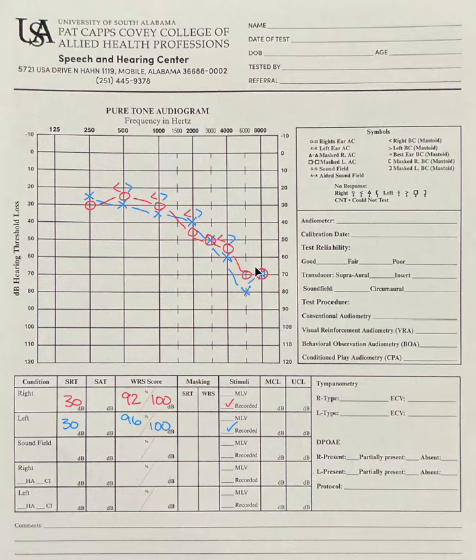Does that make sense to you? Does it sound like what you're experiencing? Most of the time, the patient will say, yes, that's exactly what I'm experiencing. And then from here, we can move into counseling on hearing aid options.